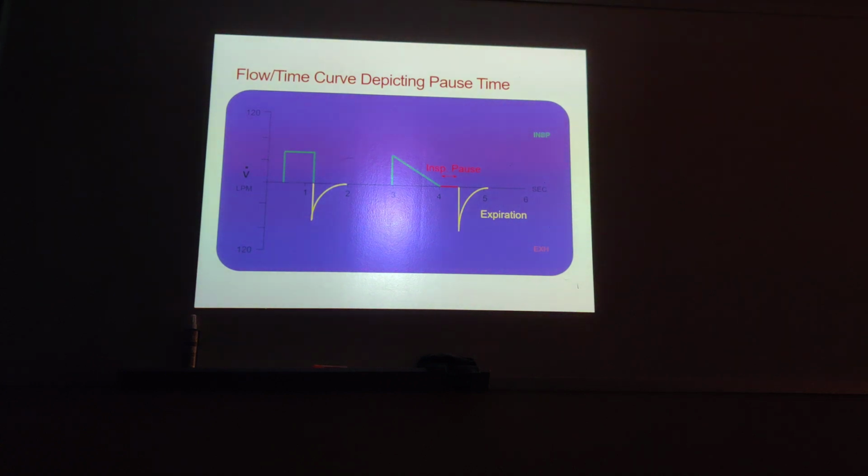Okay, so now, this here is inspiratory time from here to here, and then you have a little pause in here before the patient begins to exhale. You are using too much I time, because see, the patient is done breathing in here, but still some time is left for inspiration.